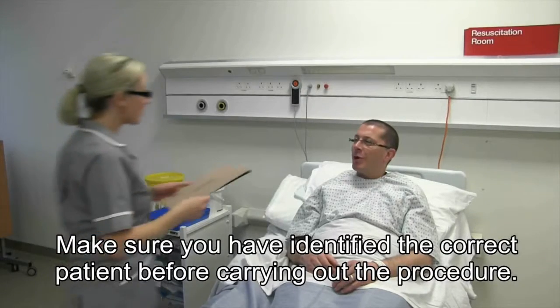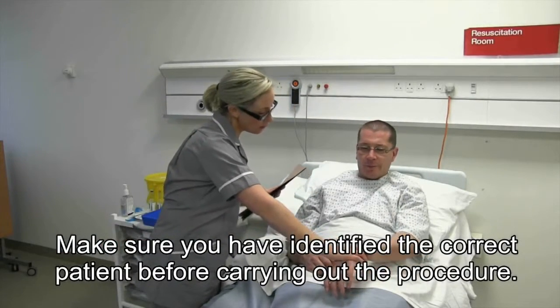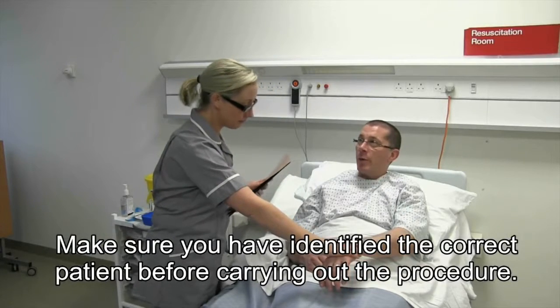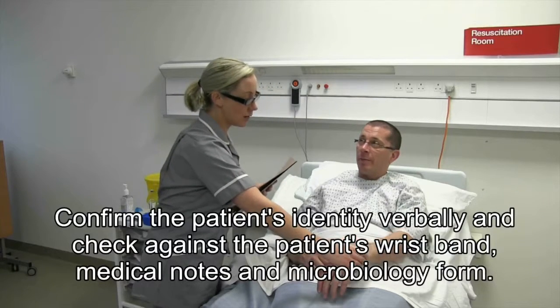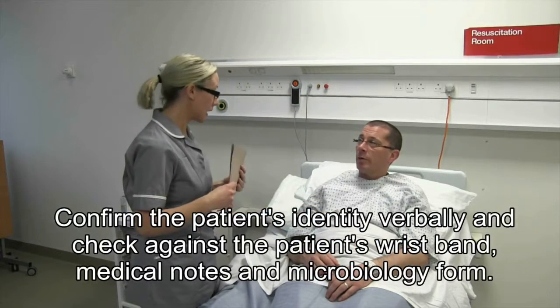First, make sure you have identified the correct patient before carrying out the procedure. Confirm the patient's identity verbally and check against the patient's wristband, medical notes and microbiology form.